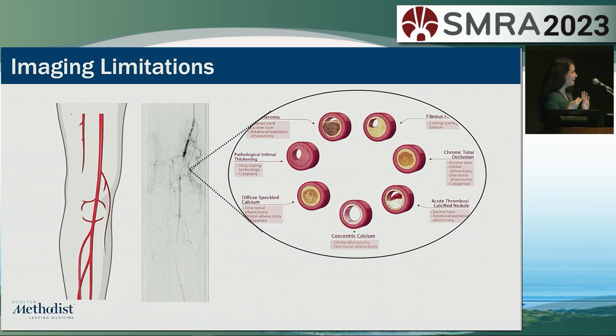While MRI studies usually focus on coronary and carotid arteries, our MRI histology protocol is now trying to pioneer applications that usually characterize PAD lesions. And PAD lesions can be very complex, can be composed of soft and hard tissue components, hard as calcium or dense collagen, soft as thrombus.